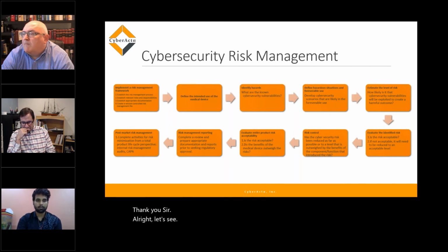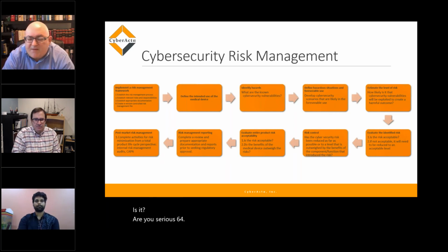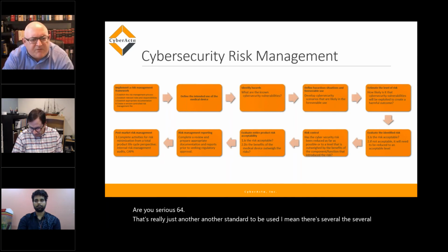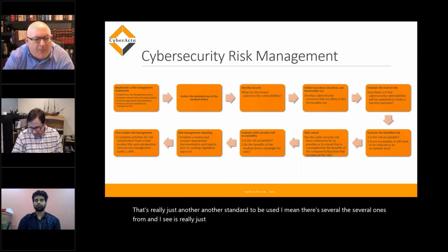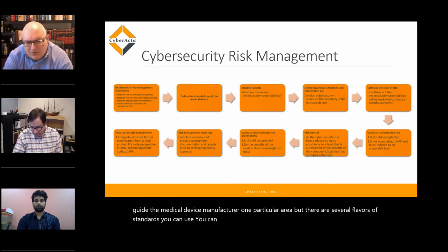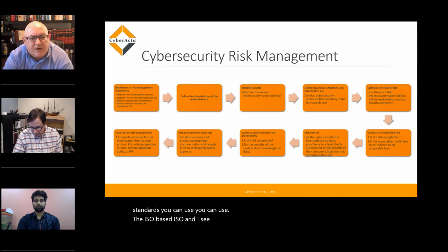He is asking, what is the use of IEC 62304 in cybersecurity? That's really just another standard to be used. Depending upon which region has adopted it, it really just guides the medical device manufacturer on a particular area. There are different flavors of standards you can use. You can use the ISO and IEC base. You can use the UL standards.